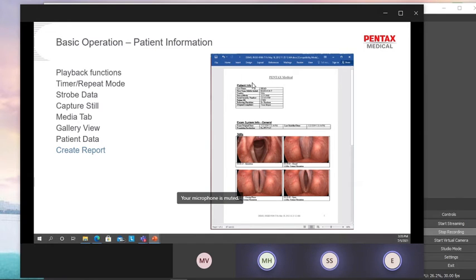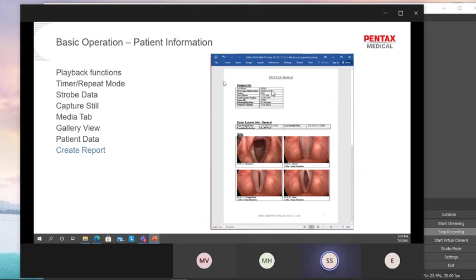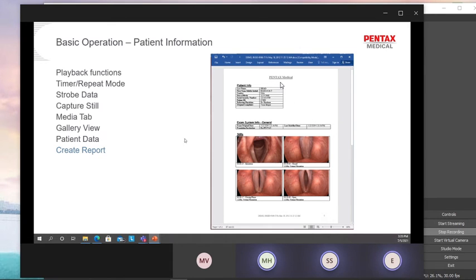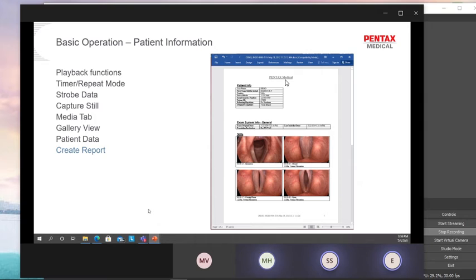Right now, no. But what you can do is you have this report in English, right? There will be some software that can do a conversion, which means you can't do it on the KDS itself. What you can do is you propagate these documents into the apps, and then the apps will help you do a conversion. It's actually doable, but it's not able to be done with the KDS. You can do it with external applications.